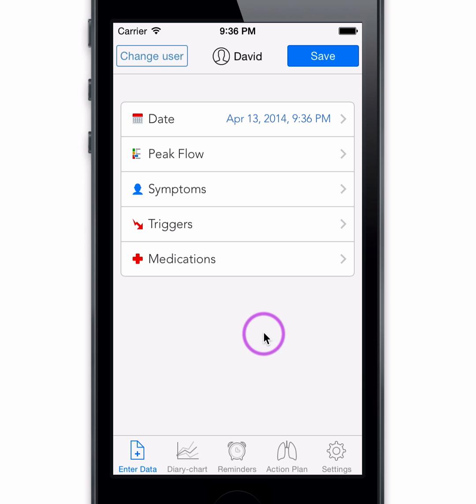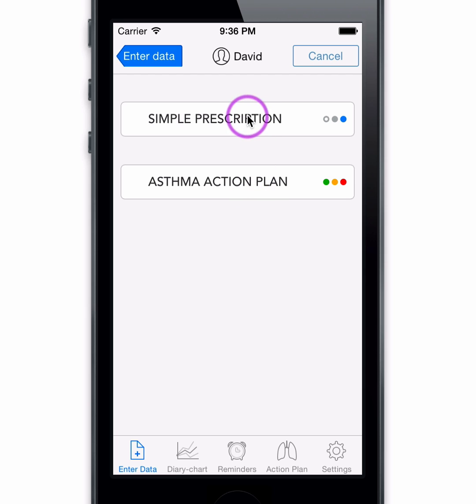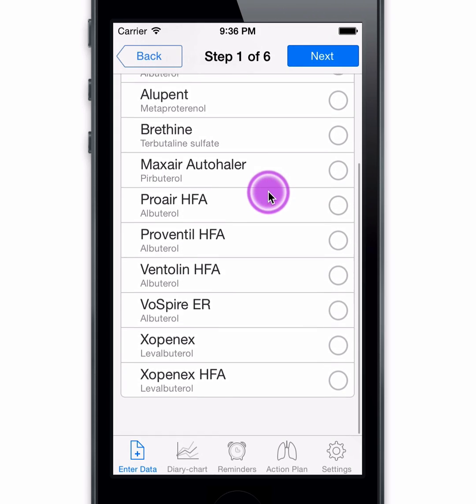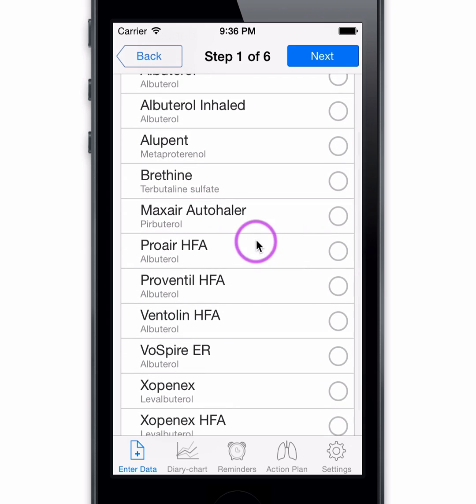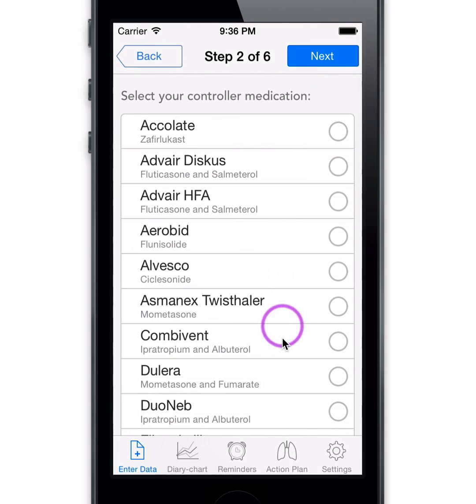We recommend you start by adding your medications next. If you have a simple prescription, you can enter it here. Better yet, with AsthmaMD 3.0, we have created an innovative patent-pending approach to use your asthma action plan. First, select your rescue medication, then select your controller medications.